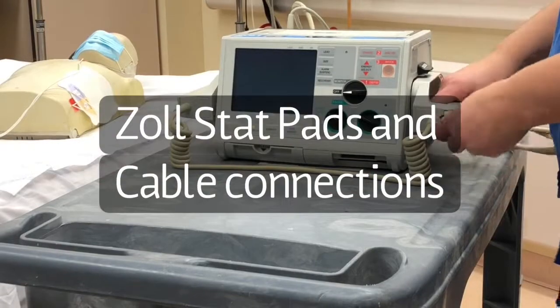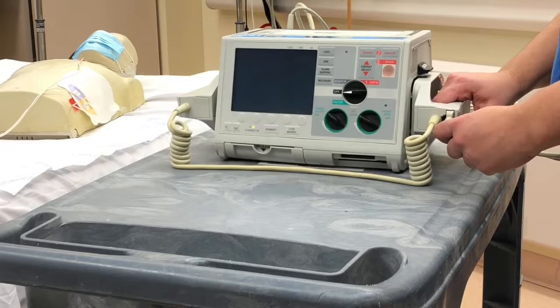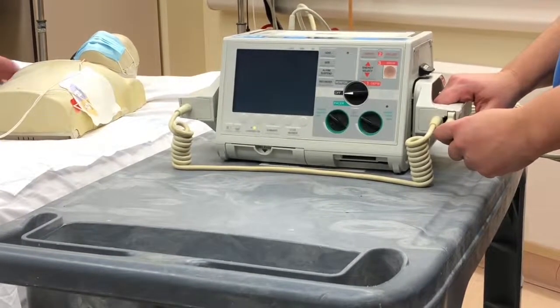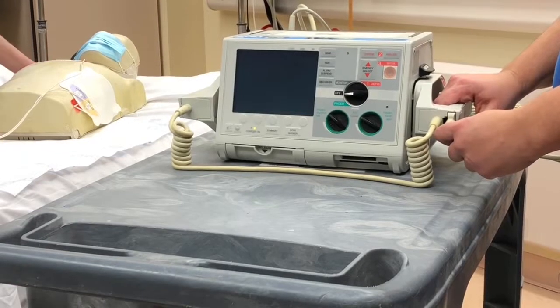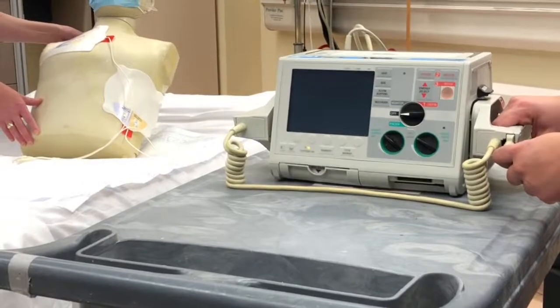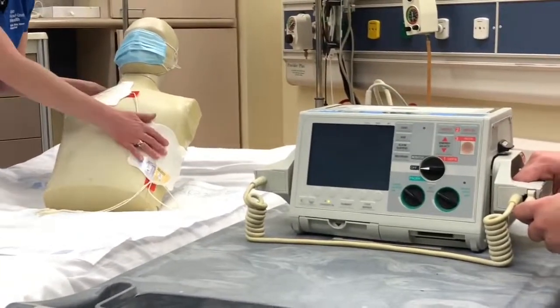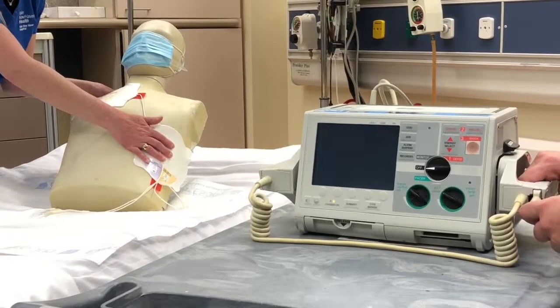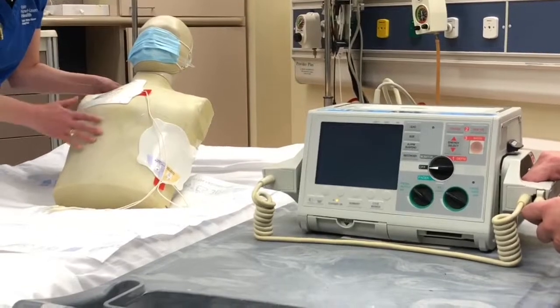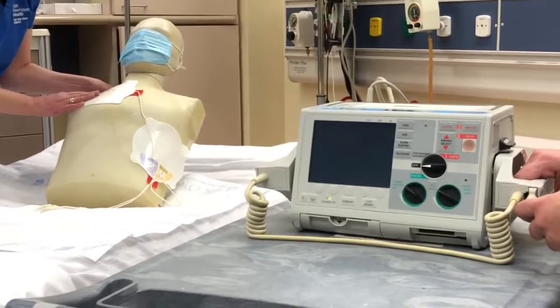We're going to show you how to perform defibrillation with your patient in the Zoll M-Series. So the first thing that you would do as you're doing compressions is make sure that the Zoll M-Series pads are placed in a heart sandwich position, so anterior and lateral position on your patient. Acknowledging that all of our patients have different sizes and body habitus, we make sure we're placing those pads correctly.